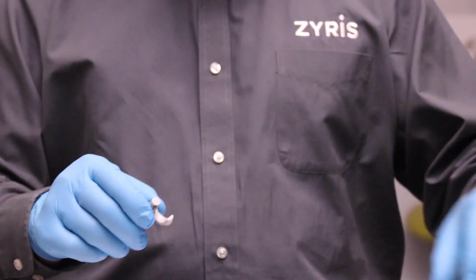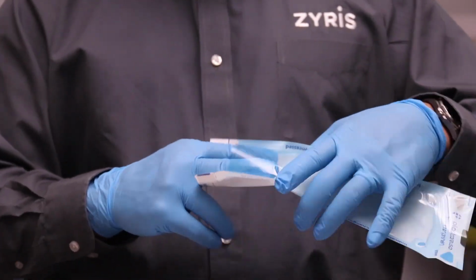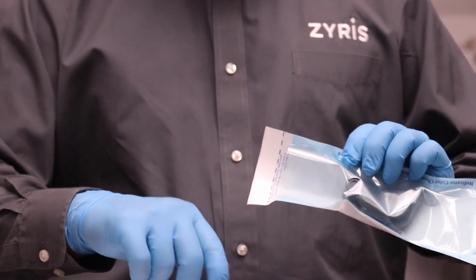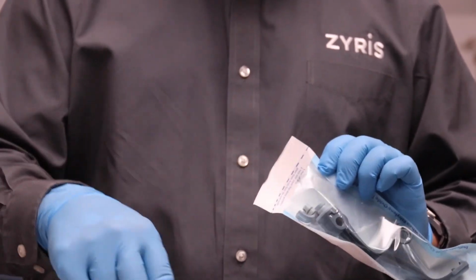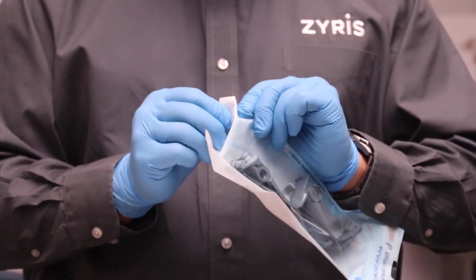Once that's done, you can take all four components and place them into an autoclave bag. And you want to do this and autoclave the control head disassembled. Please refer to the IFU, Instructions for Use Manual, for information regarding which autoclave cycles to use.